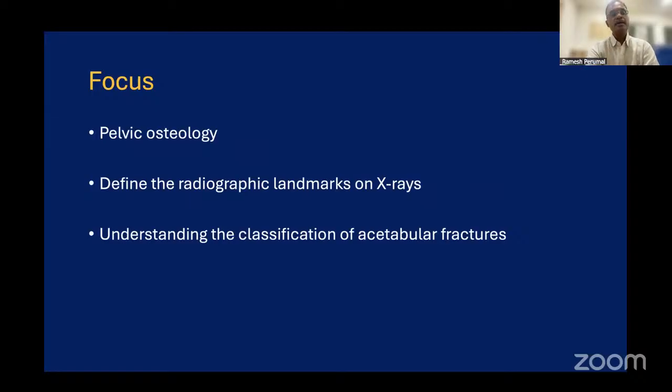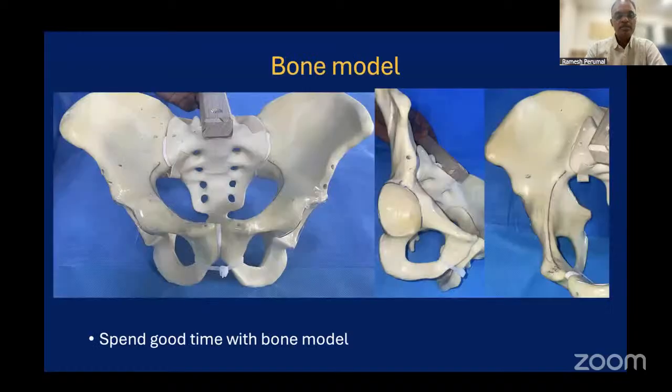Before reading radiographs, it is very important to focus on the pelvic osteology, the osteology of the acetabulum, and certain defined radiographic landmarks on the X-rays. Then we can move on to understanding the classification of acetabular fractures.